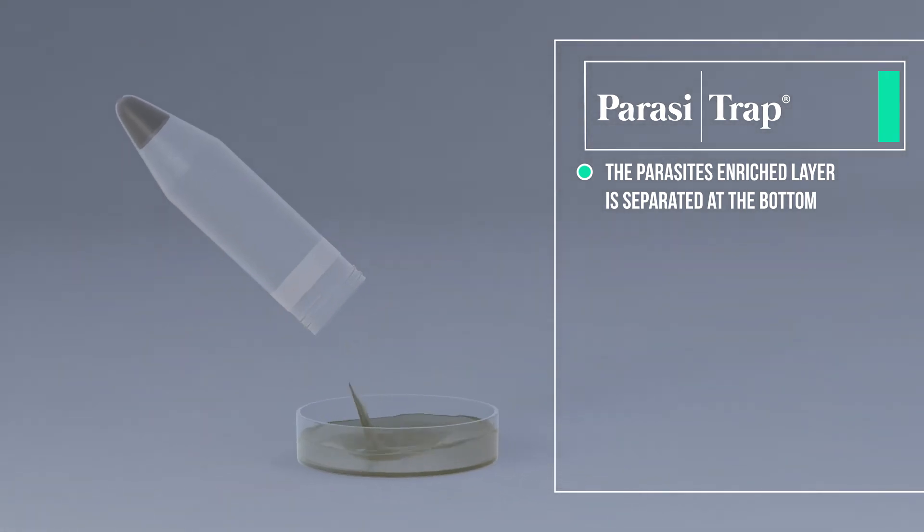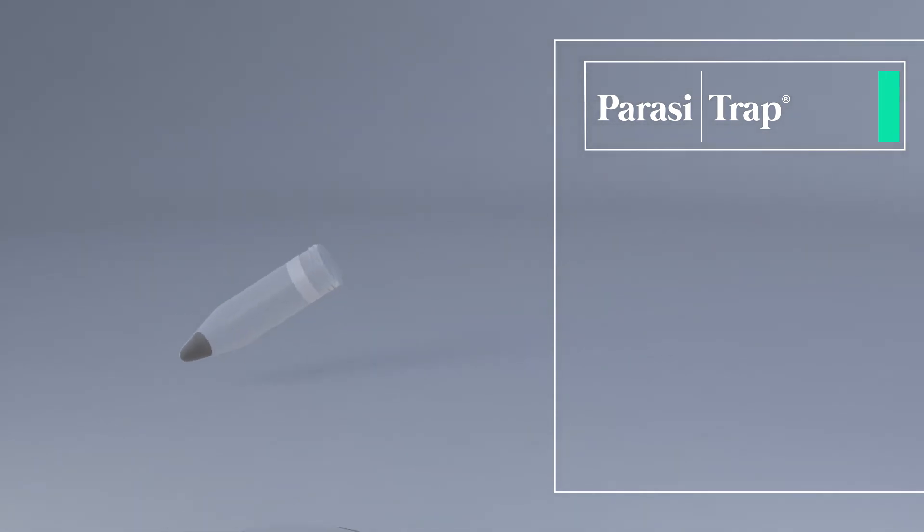Remove the top layers. The residual material is diluted and mixed with a pipette and dropped on the microscope slide.